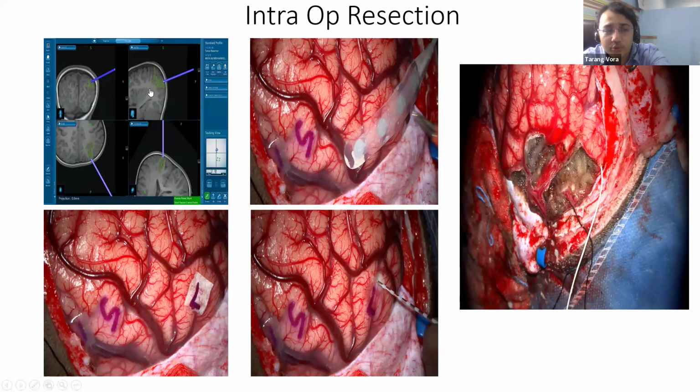The image on the left is the neuronavigation, where we have demarcated the area we want to resect, which looks absolutely normal. When we open the skull, we do our mapping. The image on the right is the subdural grid, where the epileptologist comes into the operation theater and tells us whether those areas on the surface are having any abnormal electrical discharges. Then we put a depth electrode inside to look at the deeper structures, looking for the abnormal areas. And then finally, with the neurologist continuously standing behind us and telling us, don't remove that, don't remove this, we do end up removing that much part of the brain.